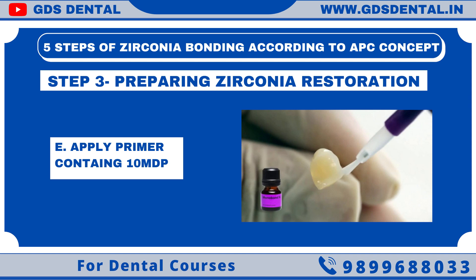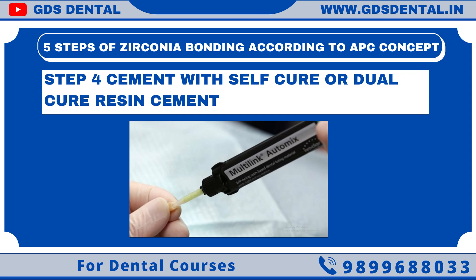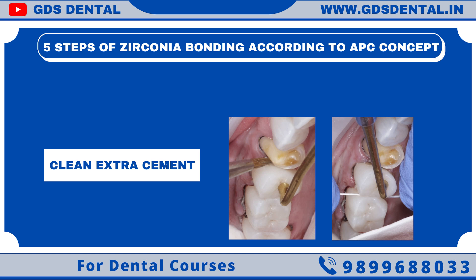After this, we are ready for bonding zirconia. In Step 4, we should use self-cure or dual-cure resin to ensure adequate polymerization, as light may not pass through zirconia. Again, 10 MDP is key to bonding, so we have to use cement containing 10 MDP. I will use Multilink. After cementation, firm pressure should be applied to squeeze out extra cement. Apply 2-second light cure initially to tack, then clean the extra cement, and after cleaning, completely cure it and wait for the setting time.